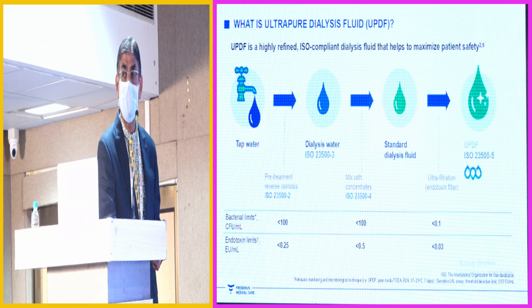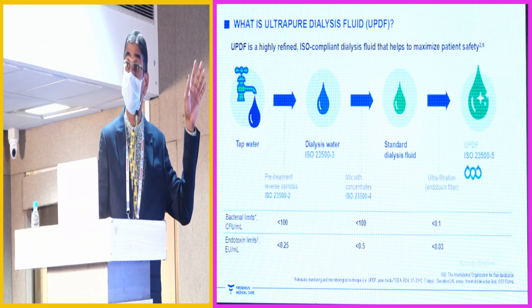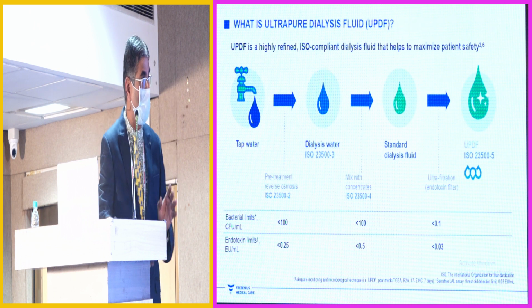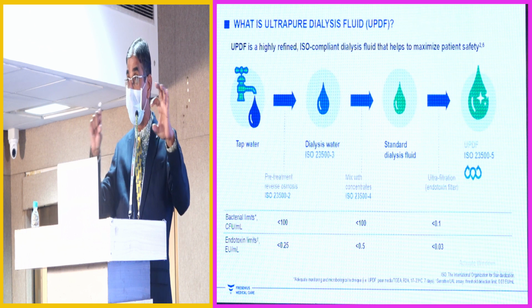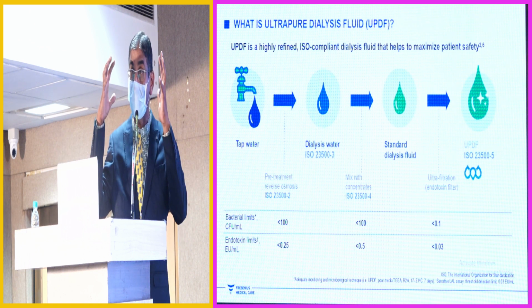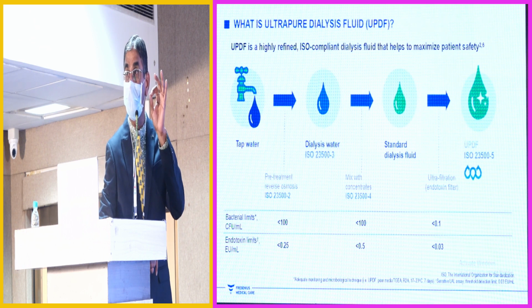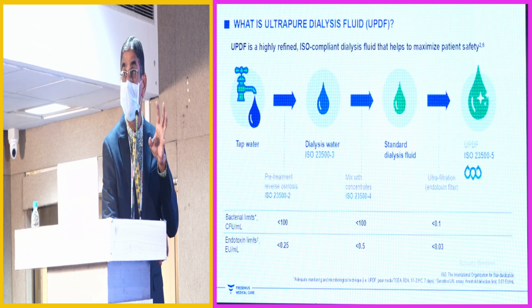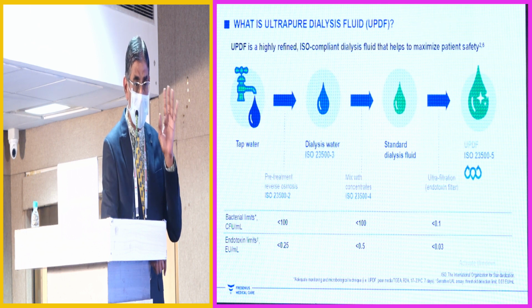If you see this slide talking about purity of the dialysis fluid, I would say the purity of the water should be taken care of. Where is the crux of the problem? We try to store the water in the tank, and then pull it through narrow pipelines to the dialysis unit, and then we see all the culprit bacteria going through the UV rays, and the cell wall of the bacteria is broken down by the UV light. What is released is LPS, and that is going to go through, especially on a Sunday morning.